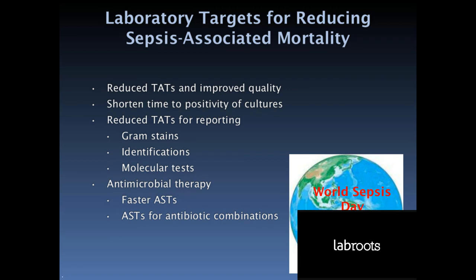Under optimal conditions, bacteria multiply about every 20 to 40 minutes. Every time they divide, they produce a positive signal. The problem is it is a weak signal that gets stronger with each generation of growth, but it currently can't be detected until 10 or more hours of growth. But the positive signal is there to be detected right from the first hour or so. What we need is better detection technology to detect positivity earlier. This should be an achievable target.